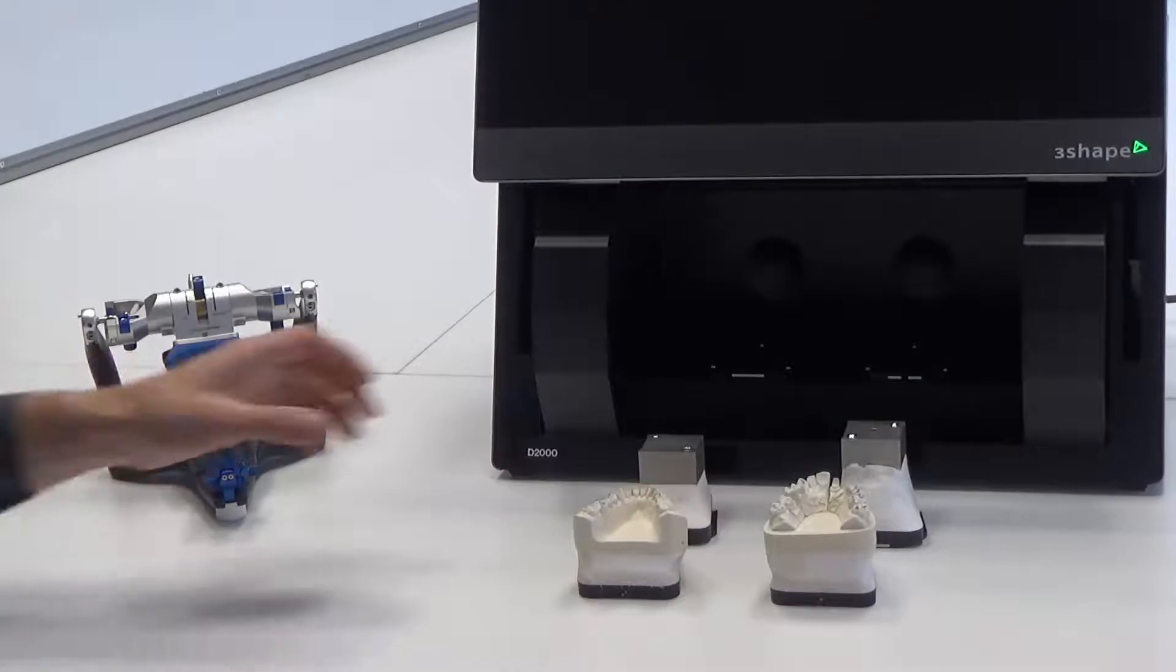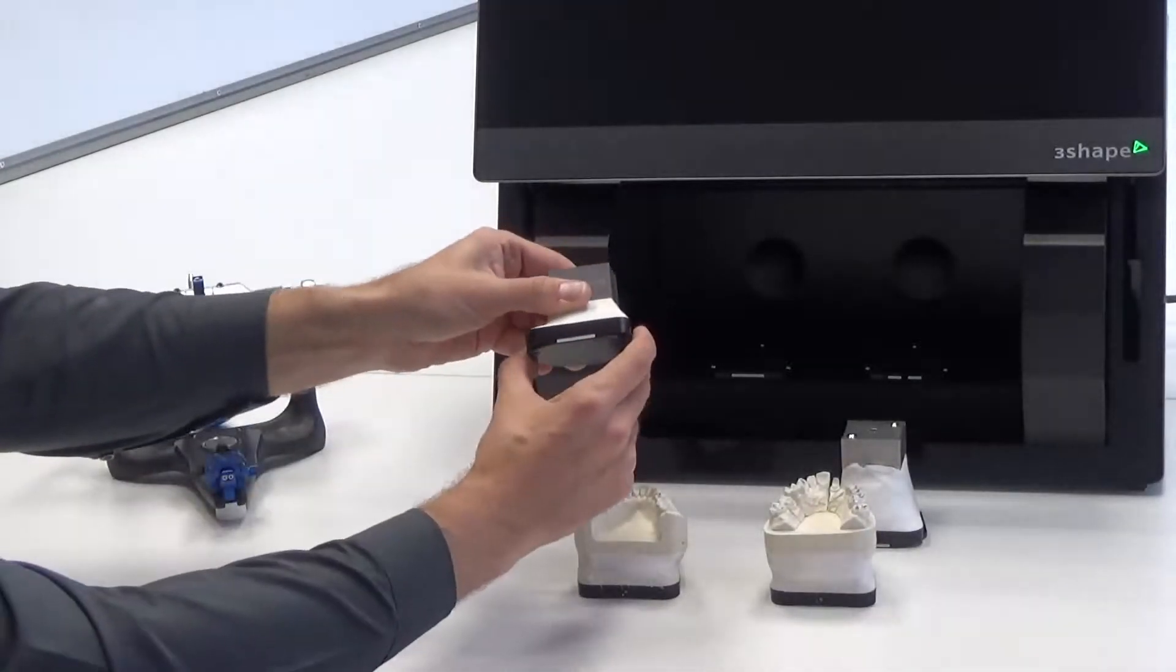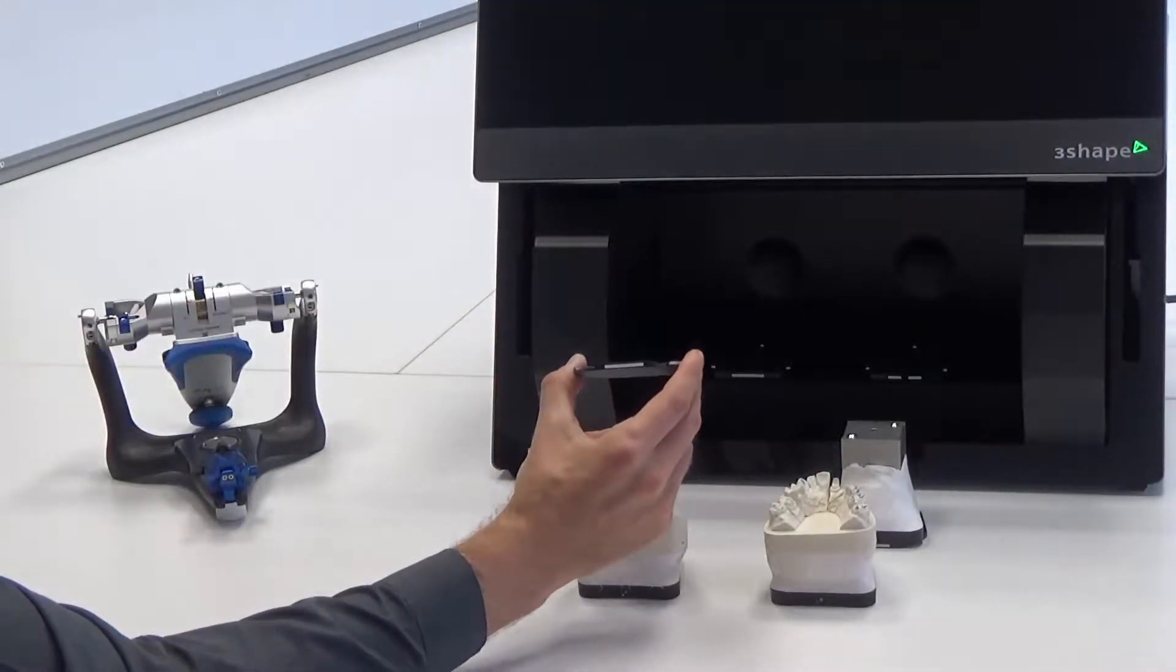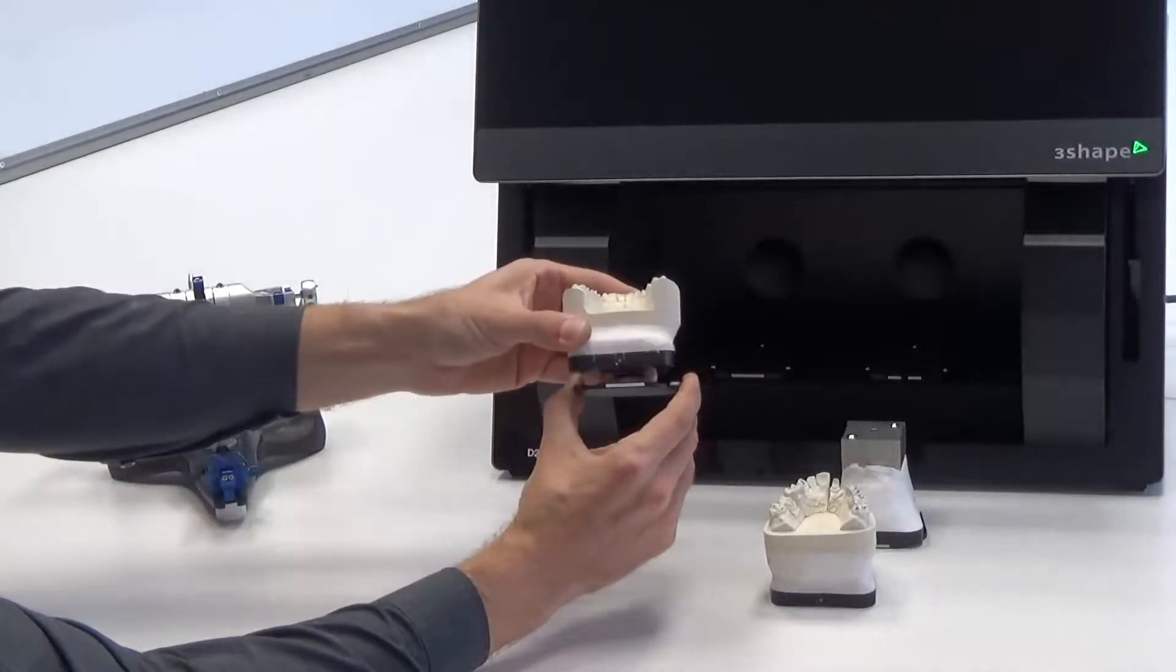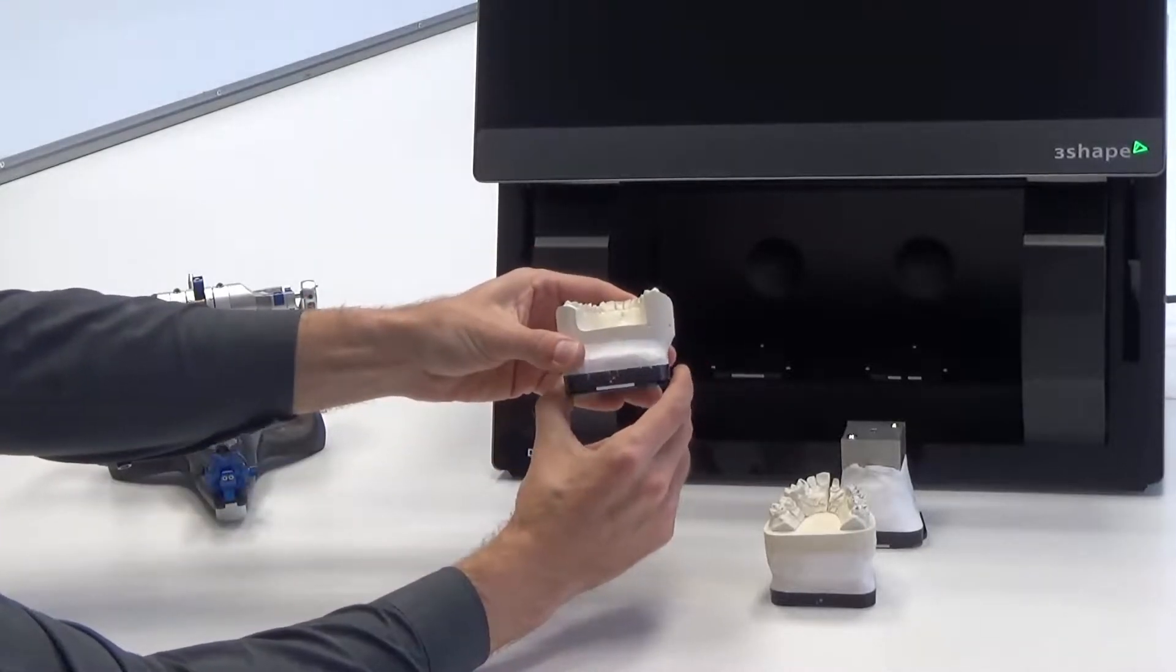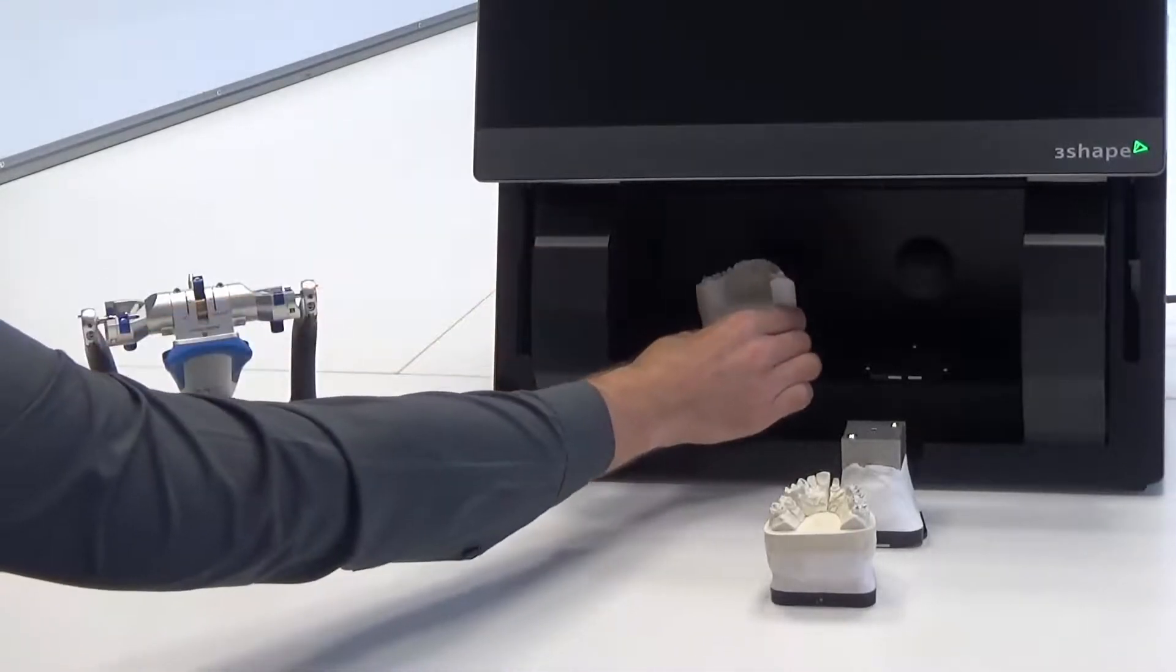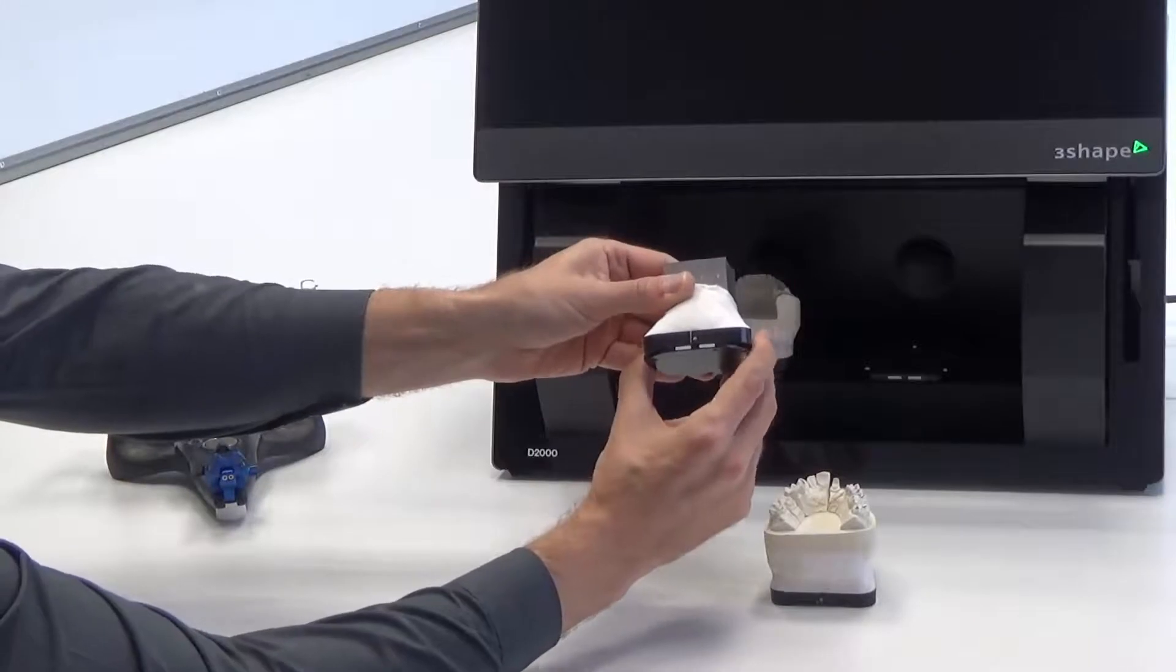Set the mounted models on transfer plates, and insert the models in the scanner. A height adapter is not required during that process. The lower model should be set on the left side, and upper on the right side.